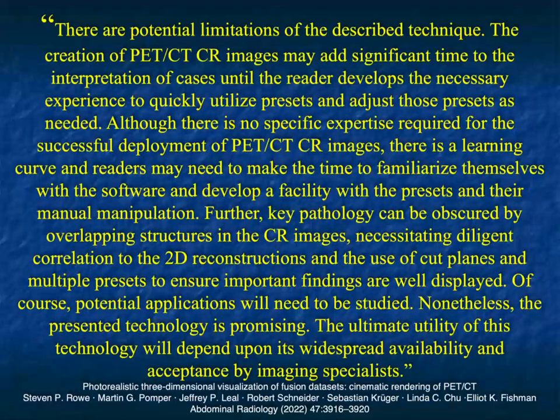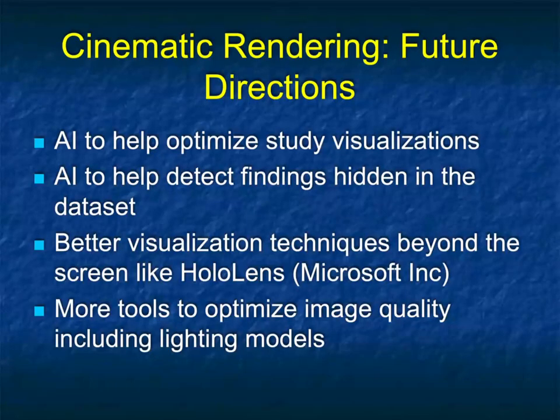There are limitations to our technique. Again, it takes time. Until we get good at it, it's going to take more time. But I think when you talk about directions and opportunities, the ability to use multimodality data sets in a display like cinematic will indeed prove to be ideal both for the radiologists and referring physicians, be it surgeons or oncologists. So again, future directions. This last talk really touched on new things.